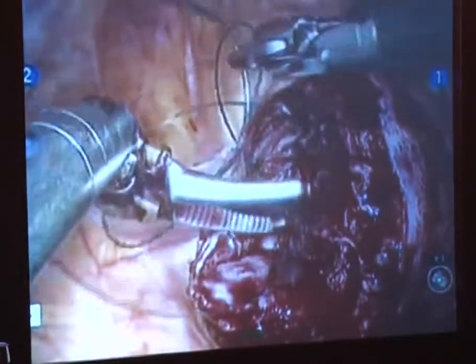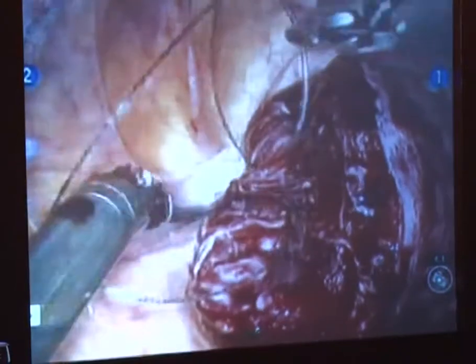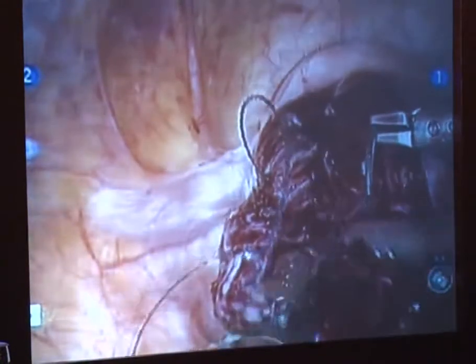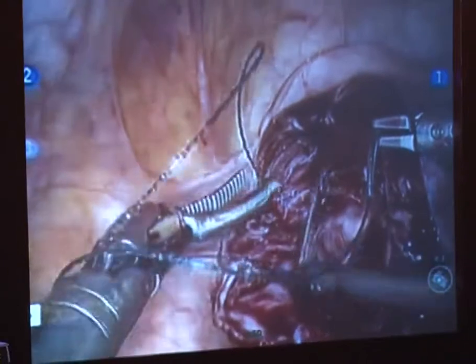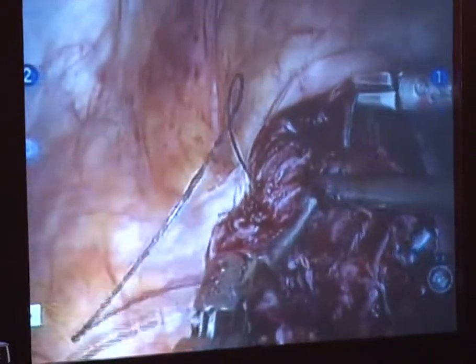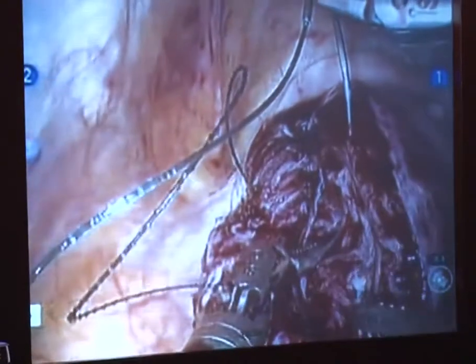So, really, at the end of the day, it's not what you would think, because notice that as you close defects with barbed suture, as it tensions correctly, the tissue actually evaginates around it. So then you end up with a nice closure.